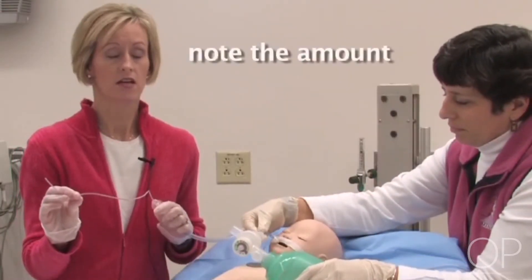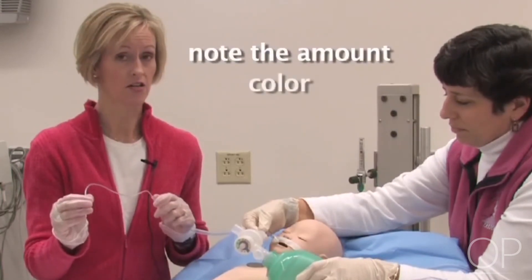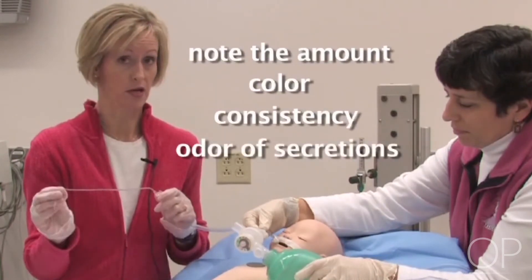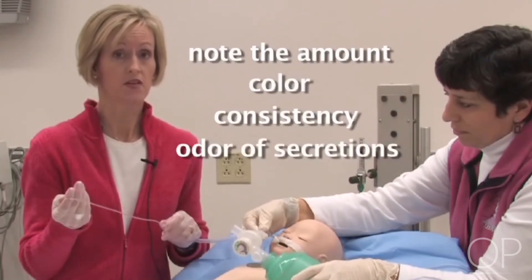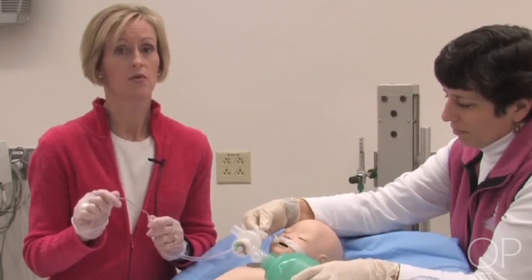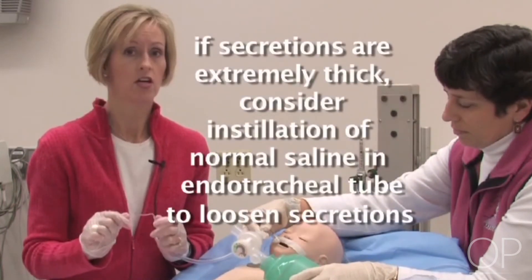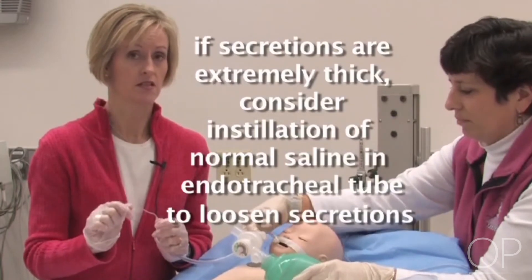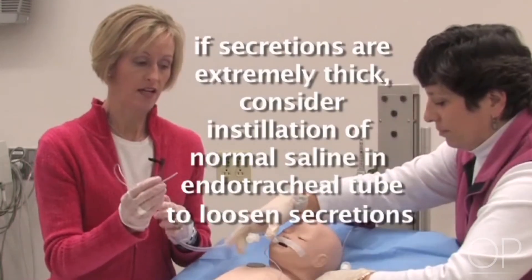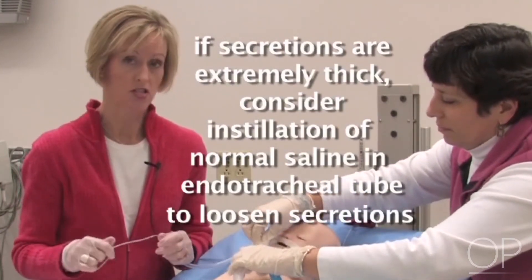You want to note the amount of secretions that you've suctioned, the color, consistency, and any odor that you might have. Also, while it's not recommended for routine suctioning, if you note that the secretions are particularly thick, you may want to instill saline down the tube and then bag the saline in, in order to loosen up those secretions.